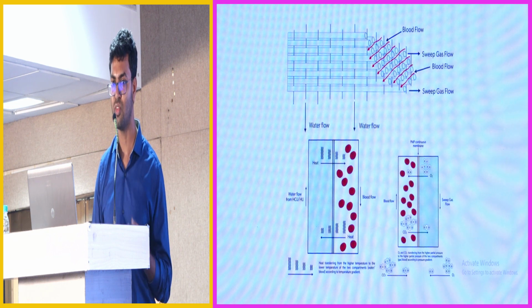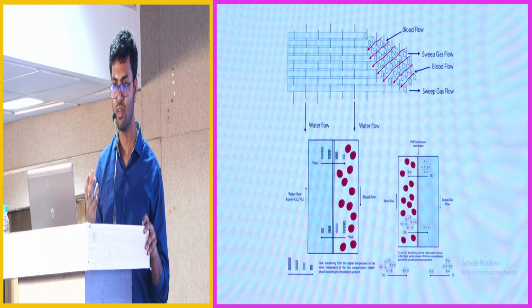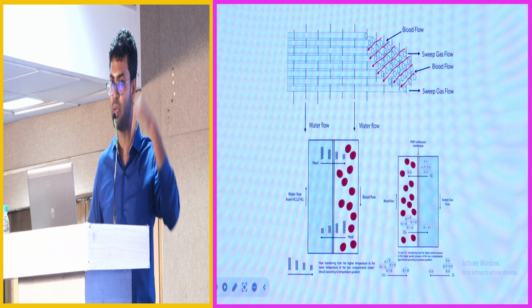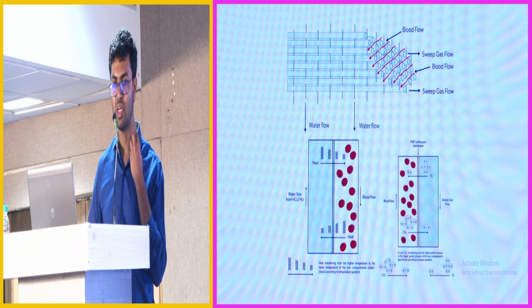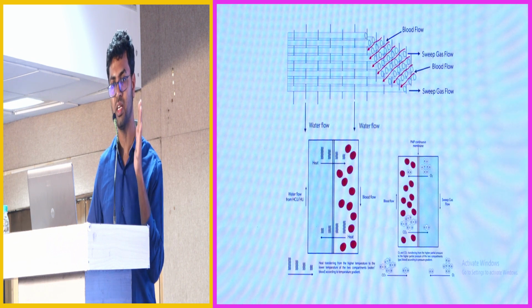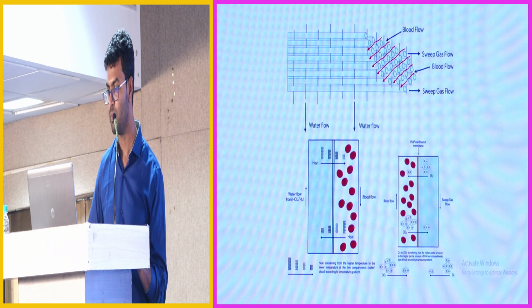So keep a watch, because sometimes the direct heat contact tubings will warm a little more, and if the water flow is set to 41 degrees in a membrane oxygenator, it will warm the patient to 41 degrees immediately. So don't do that. Try to maintain 36.5 to 37.5 degrees centigrade. That is the thing you have to maintain.